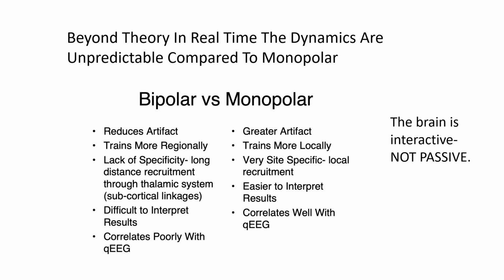is what was happening. But I actually went and did some experiments, hooked people up with a brain map cap, and then I took a couple of brain master amplifiers, and we trained them with a bipolar setup, with one brain master amp, and then we monitored them with a monopolar. I think I actually may have used two.